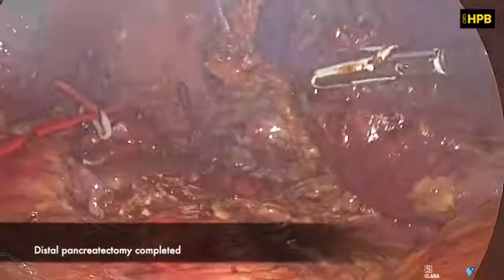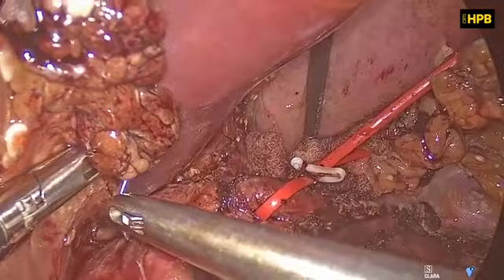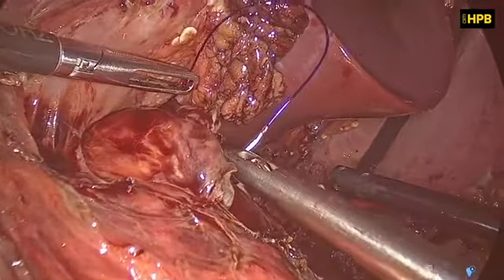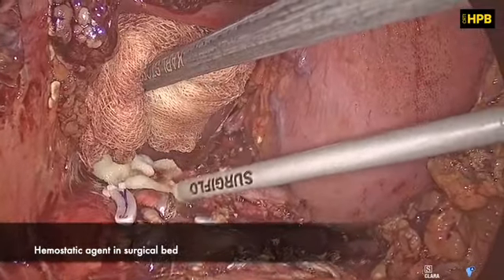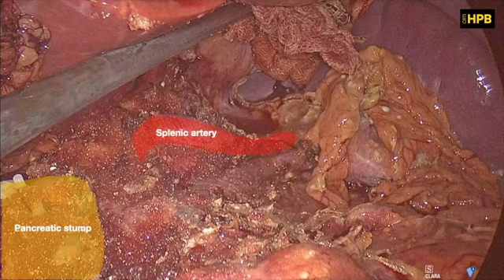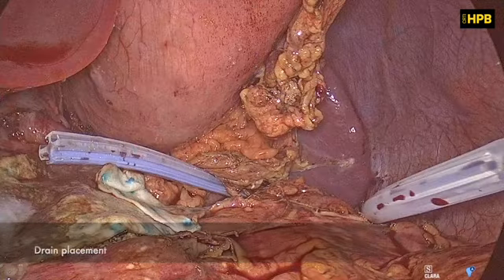After completing the distal pancreatectomy with splenic preservation, the pancreatic remnant was sutured. Then, hemostatic agent was placed in the surgical bed. In the final image, we observed the pancreatic remnant, splenic artery and vein, and the spleen. The surgical specimen was removed with an endobag. A suction drain was left in the surgical bed.